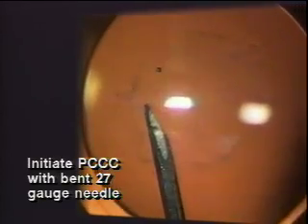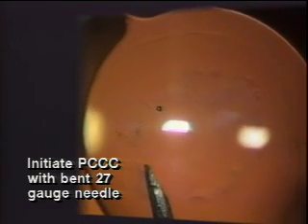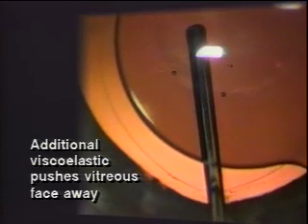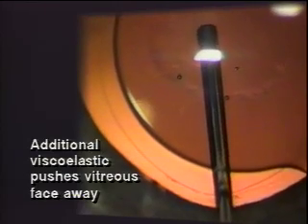Once the IOL is well positioned in the capsular bag, a posterior continuous curvilinear capsulorhexis is initiated with a bent 27-gauge needle, creating a small central puncture in the posterior capsule. Additional viscoelastic is placed through the central puncture to push the vitreous face away. A circular tear is then accomplished using CCC principles, directed radially before being turned and continued counterclockwise for 360 degrees. High magnification and liberal use of viscoelastic agents aid in performing this maneuver. Proper head positioning is essential to maintain a clear red reflex, and frequent re-grasps of the leading edge of the posterior capsular tear are useful to prevent an equatorial extension of the progressing tear.